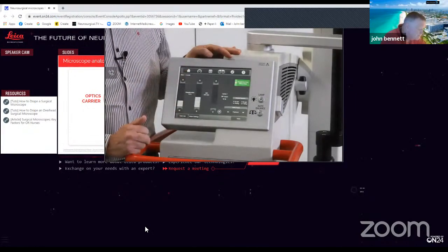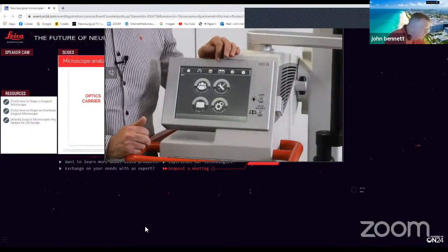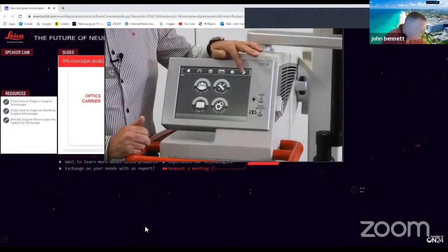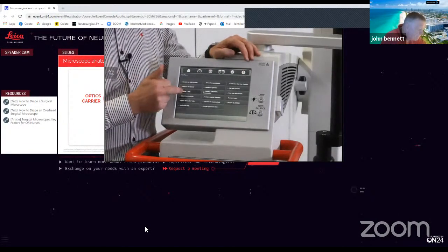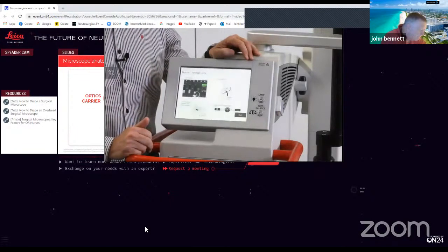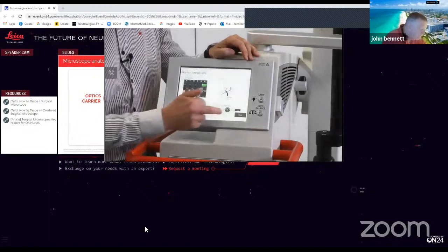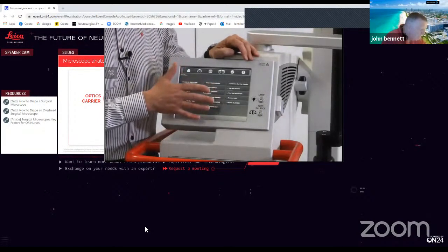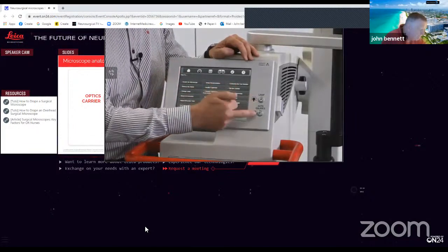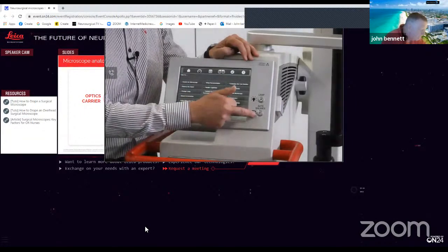We have the home button, the speed button, a menu button, and a question mark button, which allows you to look into some quick guidance on how to do single steps like mounting accessories and others. In addition to the graphical user interface touch panel, we have buttons for lamp on/off and balancing.